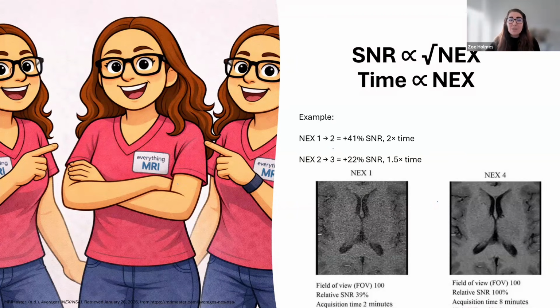When is this a bad idea? When motion is the dominant problem. When you have breath holds, a restless patient, or painful positioning, in those kinds of cases, increasing your time will introduce motion artifacts and will compromise your image quality and your ability to produce diagnostic images.